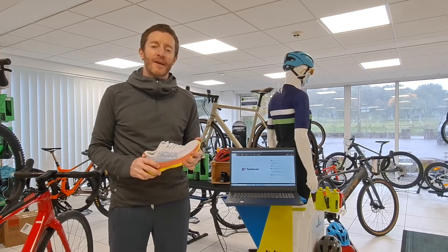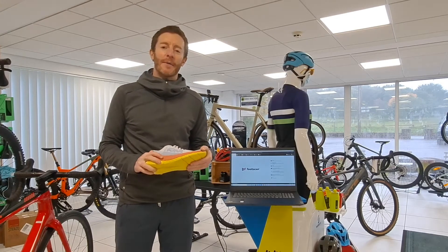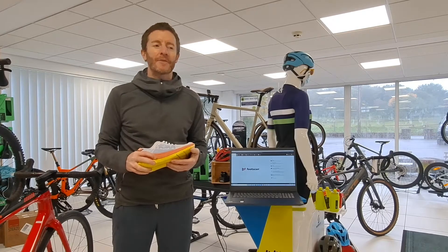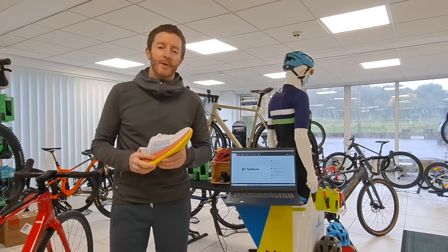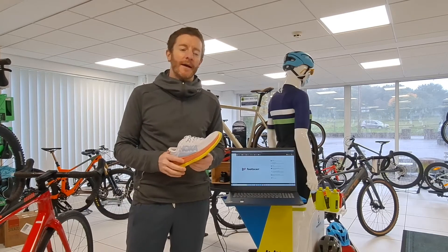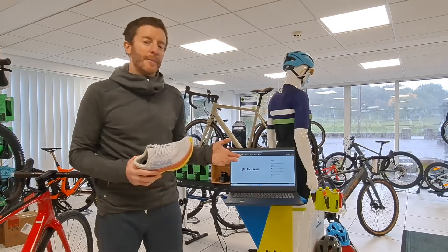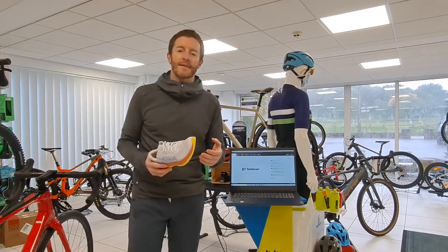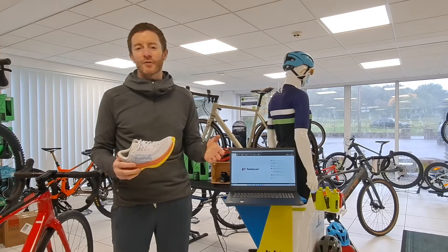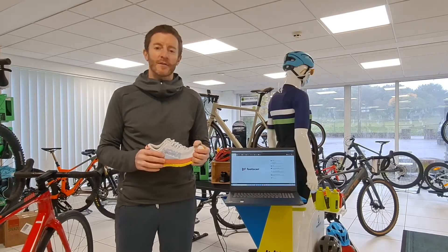Hi guys, we thought we'd just take a few moments to talk about our new system for gate analysis — that's more than gate analysis but that's the key point of it for us right now. It's a new system from Footscan, and in effect it takes gate analysis and pushes the boundaries of where it's pretty much stood technology-wise for years and years.